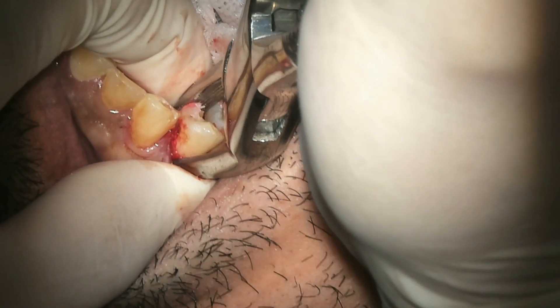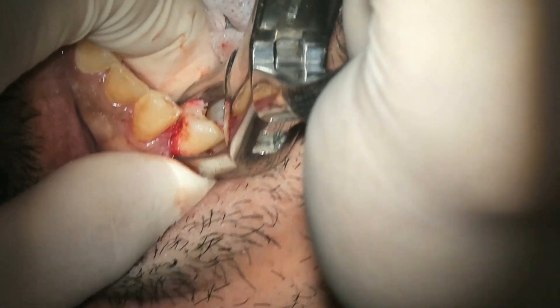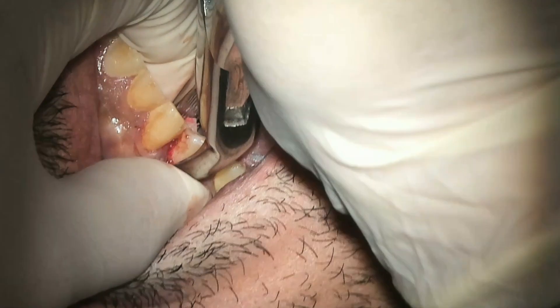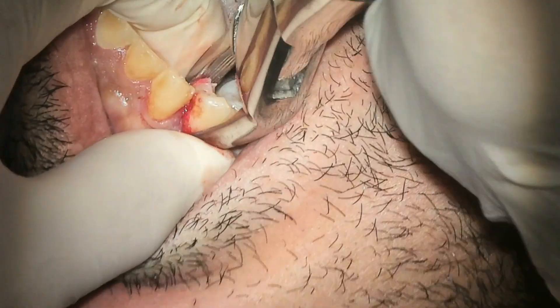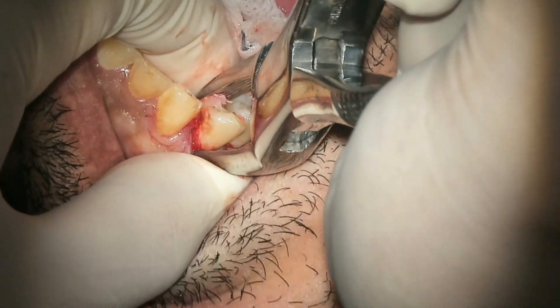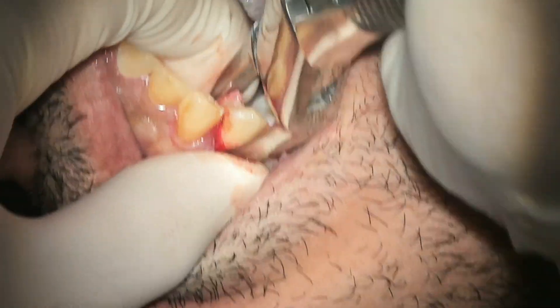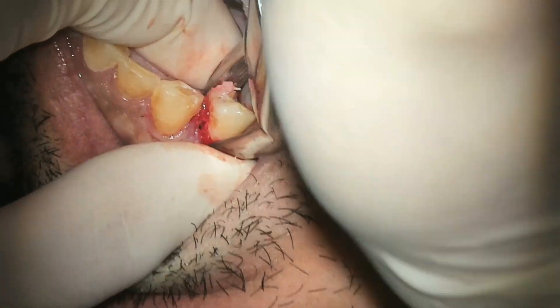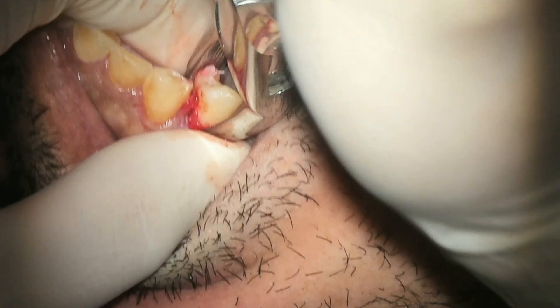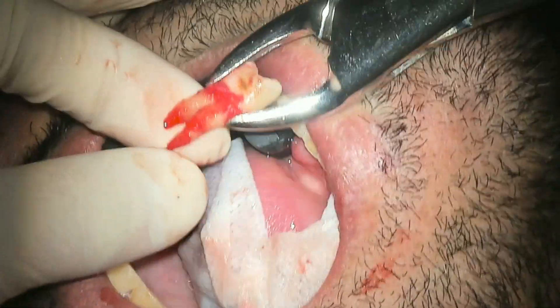Now, when we have the forces on the root structure and the crown is moving, we know that the entire tooth is moving in that bone, and we're causing a lot of expansion to that bone, which is good. We don't want to place the forceps too high up onto the crown, because when we do that, we're looking at crown flexure instead of the actual tooth moving. So here we're holding the tooth towards the buccal and rotating it in a figure-eight motion. I'm holding it towards the buccal because I know that's where the tooth wants to go — the buccal expansion I'm feeling with my thumb tells me we're compressing the bone within a safe limit without fracturing the buccal plate. And here the tooth is out. You can see how apical the forceps are onto the root.